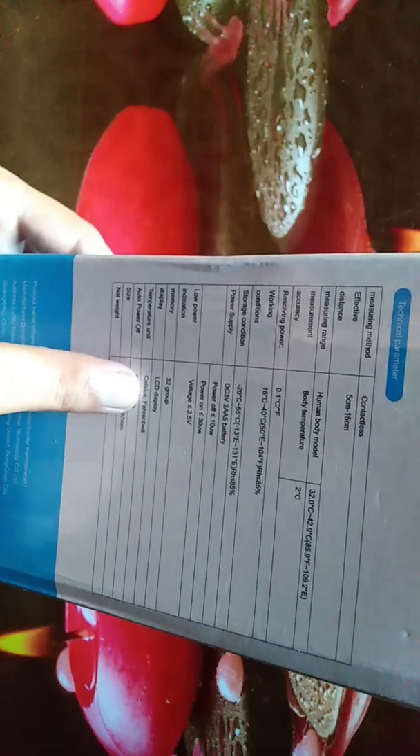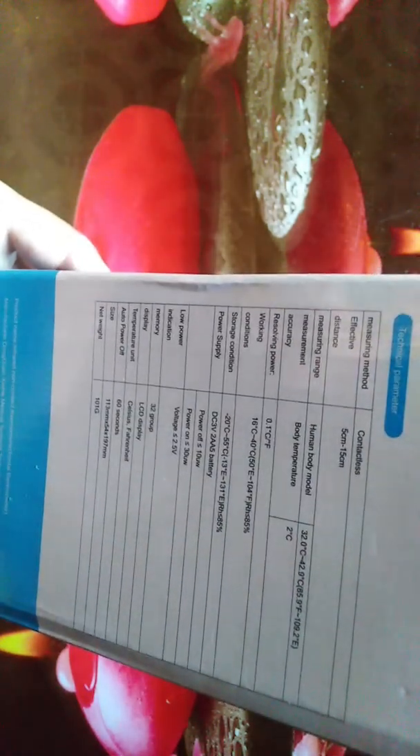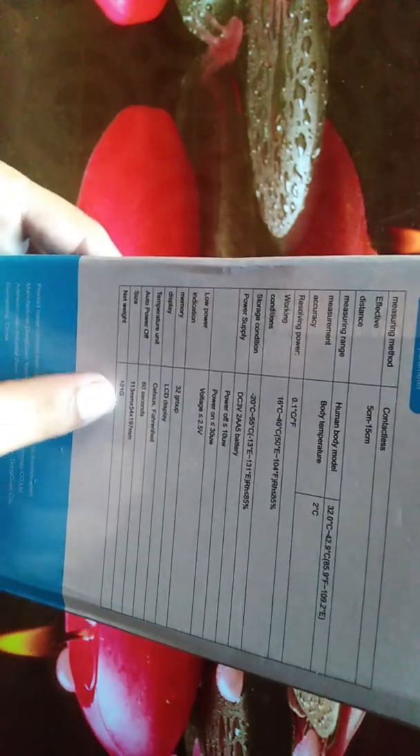It has a low power indication, memory of 32 readings, and an LCD display which you will see when I unbox it. The temperature unit can be Celsius or Fahrenheit. The auto power-off means you don't need to manually power it off — it will automatically turn off after 60 seconds. The size is 113mm x 54mm x 197mm and it weighs 101 grams.